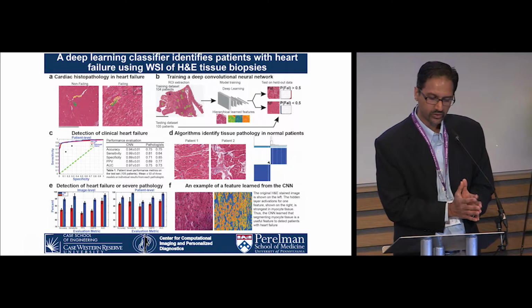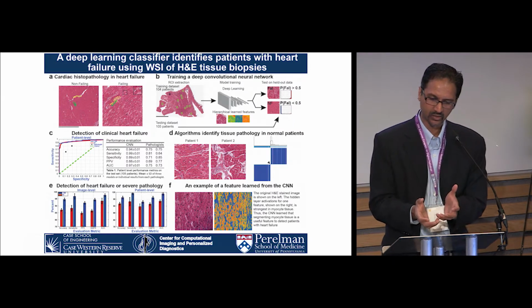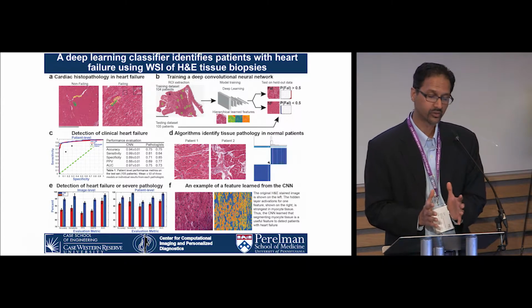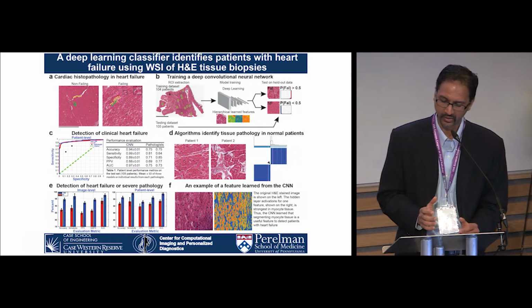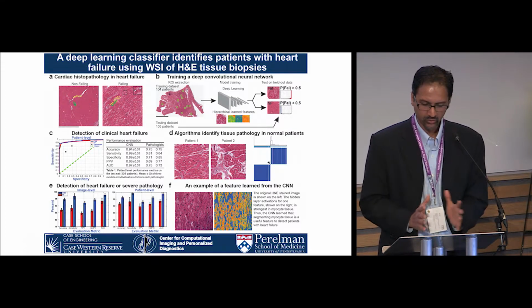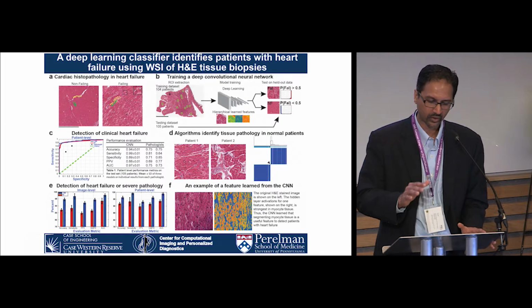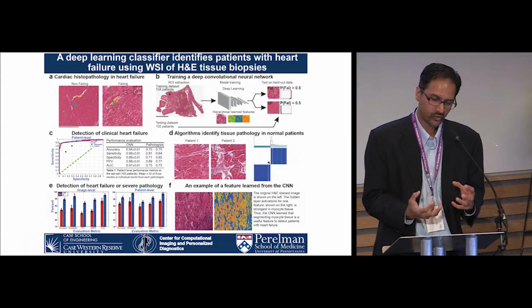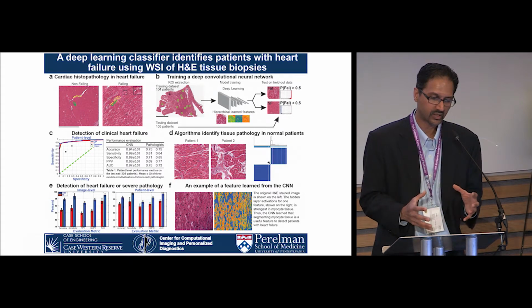So yes, we've used it to identify specific targets of interest. We had previously published work where we showed that we could find regions of invasive ductal carcinoma from whole slide images very quickly and accurately. But this was a new foray for us, because now we were saying, just given a set of slides, could we render a patient-level diagnosis based off just that information at a whole slide level?